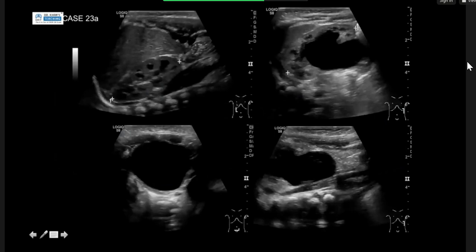So candidate 3, it's your turn again. Do you want to have a go at this case?